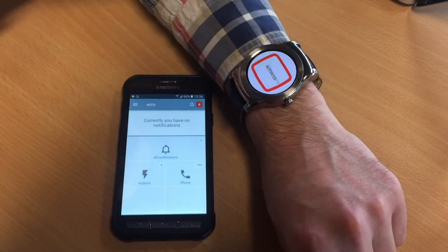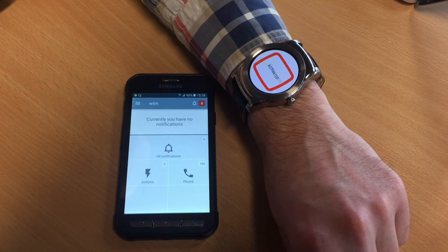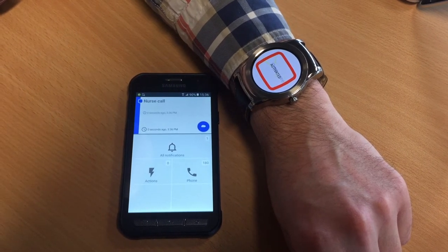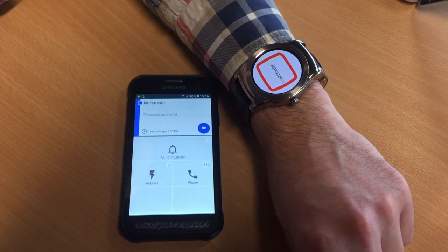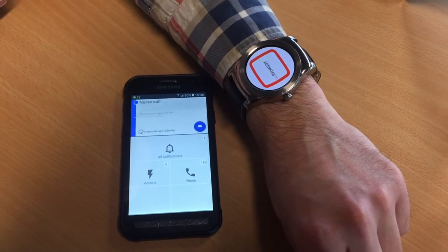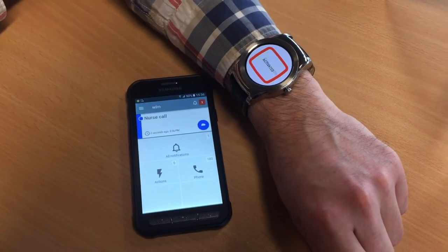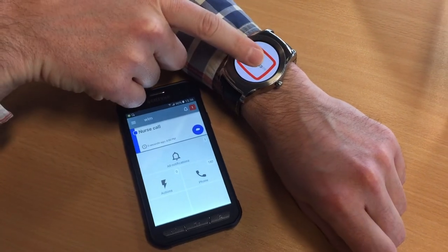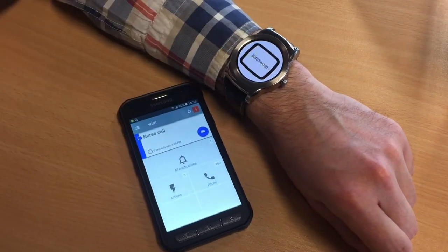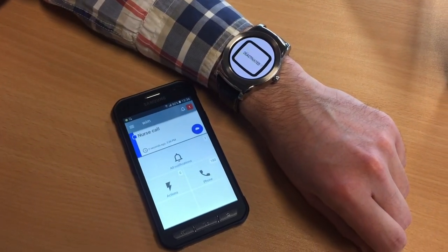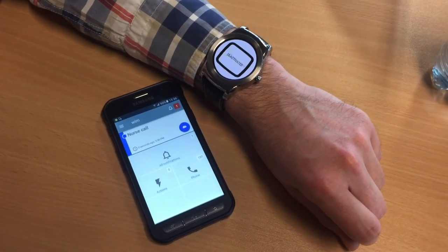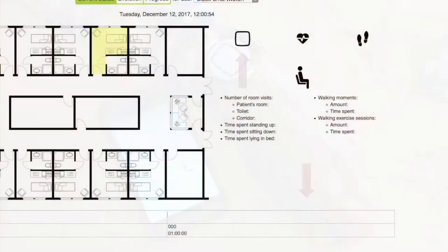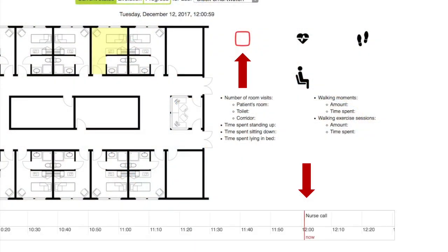Likewise, if the patient explicitly presses the nurse call button on the watch, which simulates the textile integrated nurse call button developed by Televik, Santexwell, and Alsico, the system informs the nurse in charge through the dashboard and the smartphone.